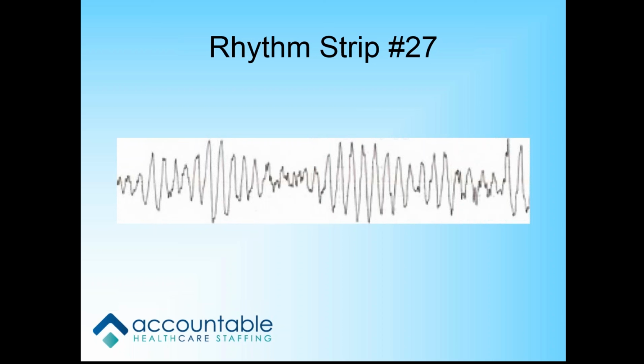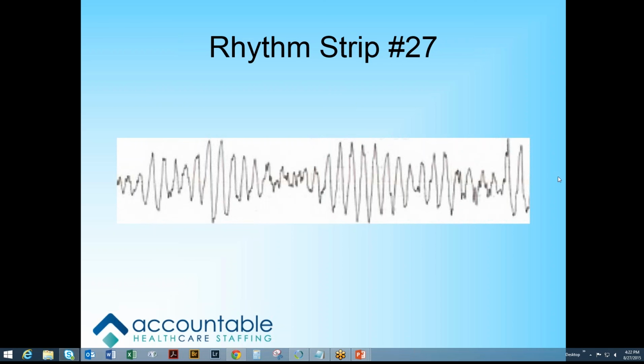VFib, and like I've said multiple times, your first treatment for VFib is shock. You have to deliver electricity. That's their best chance of survival. You need to know normal sinus rhythm, and normal sinus rhythm with PVCs, which we've covered. You need to know second degree heart block and that it's Wenckebach or type 1. And once again, all of the lethal rhythms are VTAC, VFib, asystole, pulseless electrical activity, and torsades. I just got a message telling me that they do provide you with calipers. Okay, ladies, any questions?